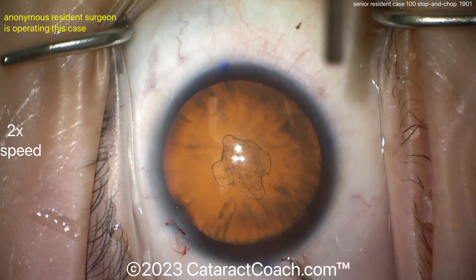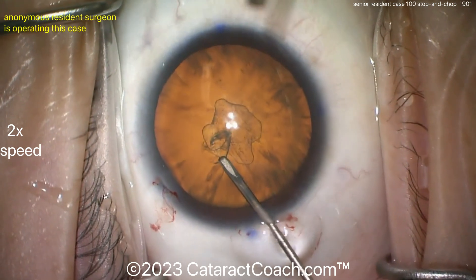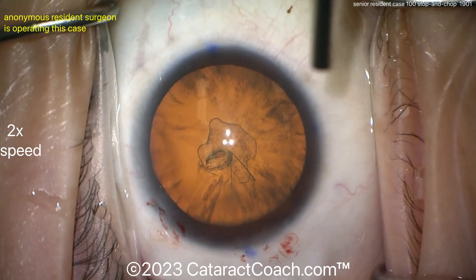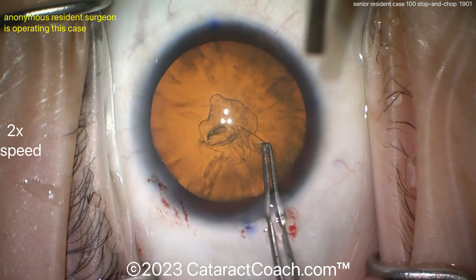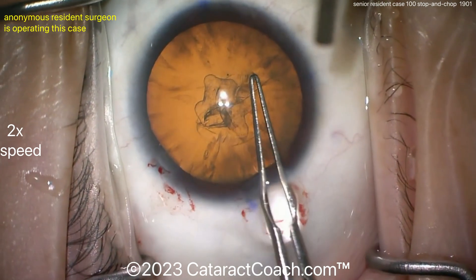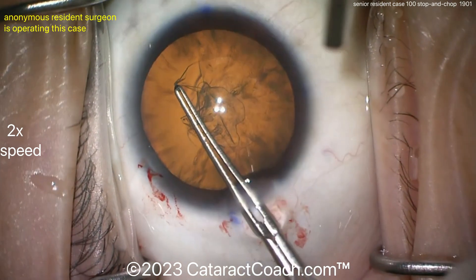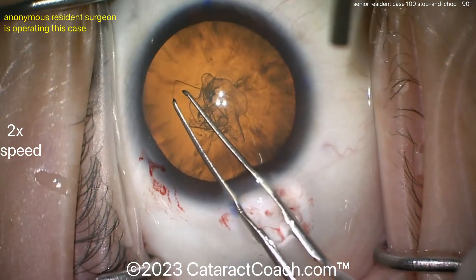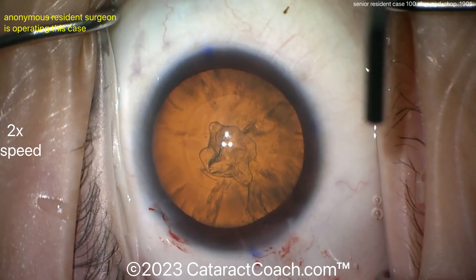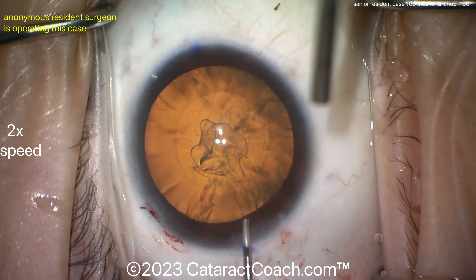Let's see the rhexis technique — starting off with the cystotome. I'm going to watch the video for the first time with you, so we're watching this together. That rhexis looks a little on the small side to me initially, but it'll be enlarged with the forceps. Nice technique, floating in the incision — nicely done. Very round, and I like how the rhexis was expanded from the initial flap. It's a pretty good rhexis — I'd make it a little bigger, but it's really good for case 100.